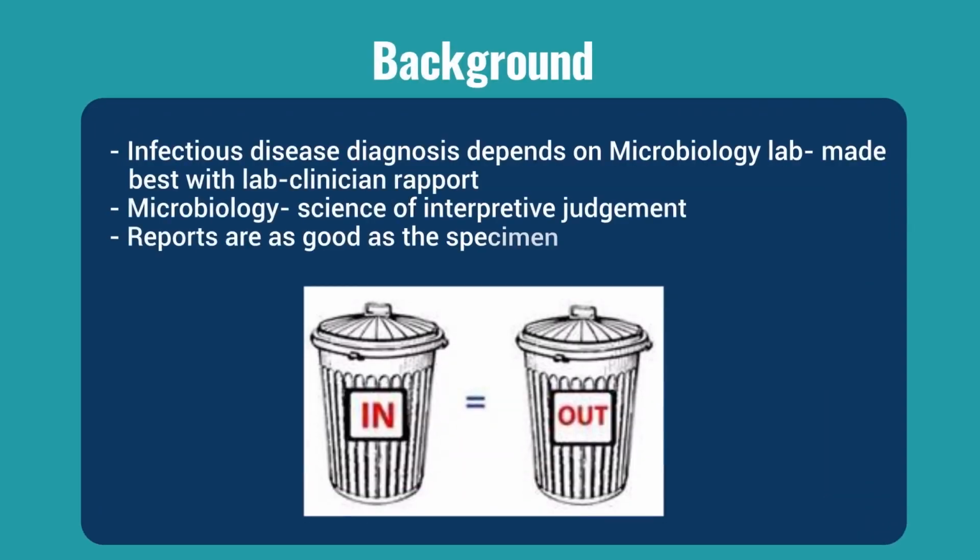Clinical microbiology is a science that deals with the diagnosis of infections. So this is also very much dependent on a good rapport between the lab and the clinician. And this diagnosis is made best with the availability of the most important parameter, that is an appropriate specimen. So the common dictum of garbage in, garbage out really applies to microbiology because this is a science of interpretive judgment and only the quality of the specimen will determine the quality of the reports as well.